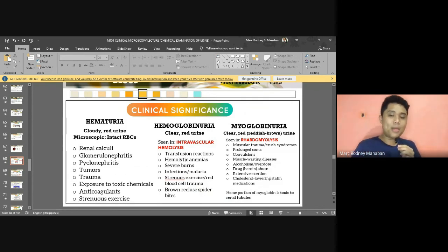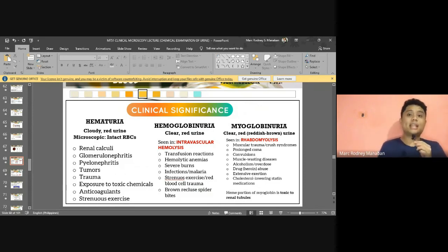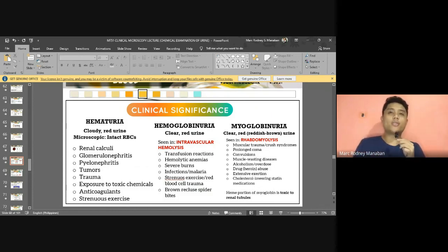We have two methods, no? Because again, remember that kanis lang tulo mo, positive kinis na sa blood reagent strip. Pero at least ang hematuria, ihang positive kay na ay speckled na yung mga dots. So later, sa positive results, color changes na reporting. Pero for hemoglobinuria and myoglobinuria, they all exhibit a positive, uniform yun na color. Alright? So, how do we differentiate? We then look at different tests.